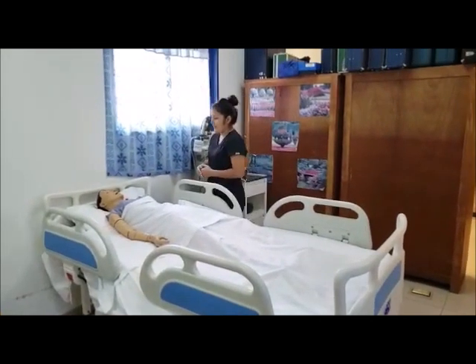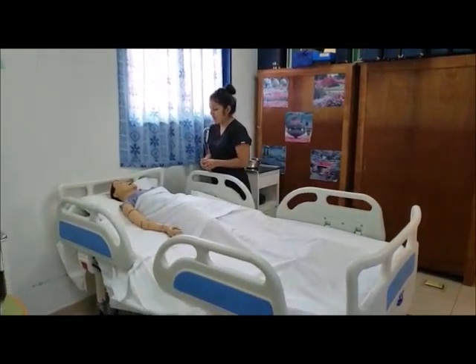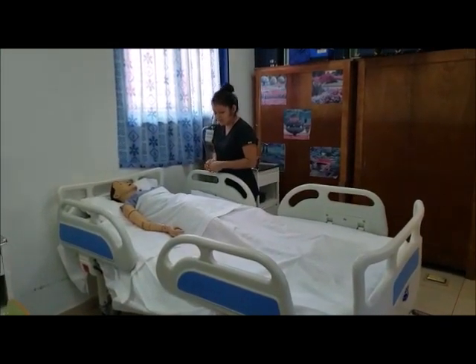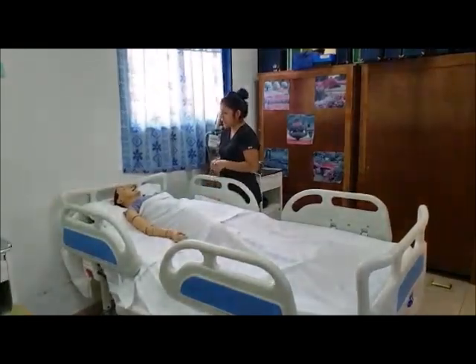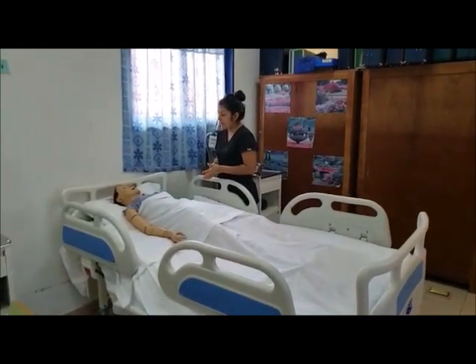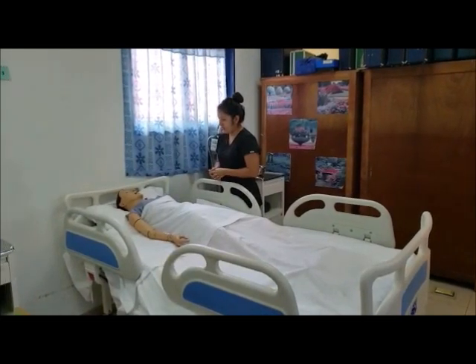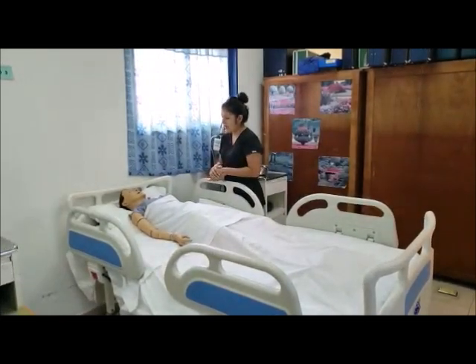Hello, good morning. My name is Nurse Rocio. How are you doing today? Okay, can you please tell me your full name and your date of birth? Okay, Mr. James, so today I'm going to be cleaning your stoma and replacing your bag, okay? Is that okay if I go ahead and do that? Okay, so I'm just going to wash my hands and then I'm going to come back with my equipment, okay?